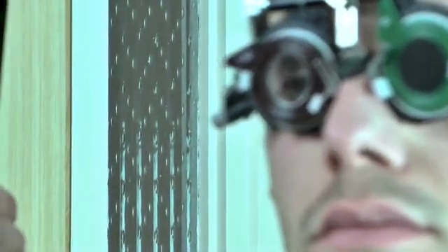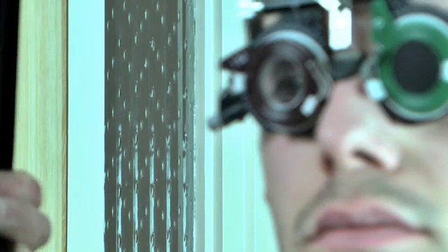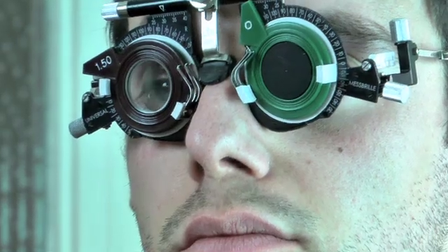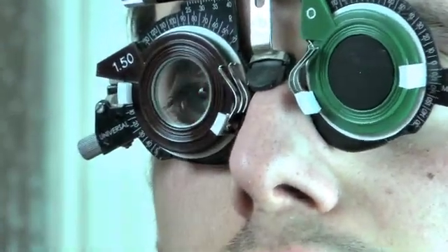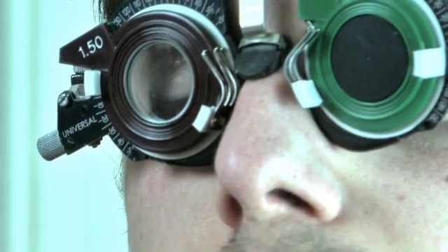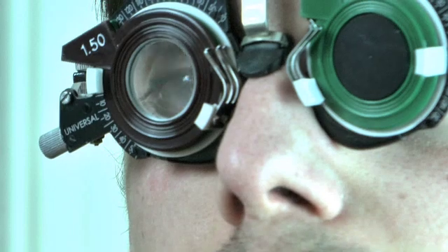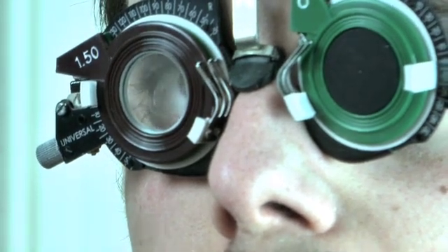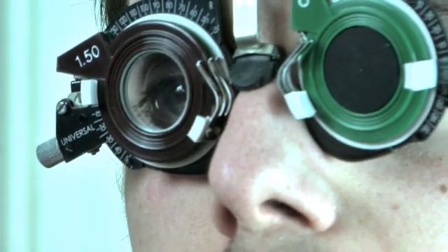Until you get to that point where they can see no better. It may be that the letters look a bit smaller or a bit darker, but if they don't see any better, we still need to stop at that point. Because we don't want to put too much minus in there, because his eyes will start to accommodate. So remember, with short-sighted people, we need to use the minimum amount of minus to achieve the best visual acuity that we can.